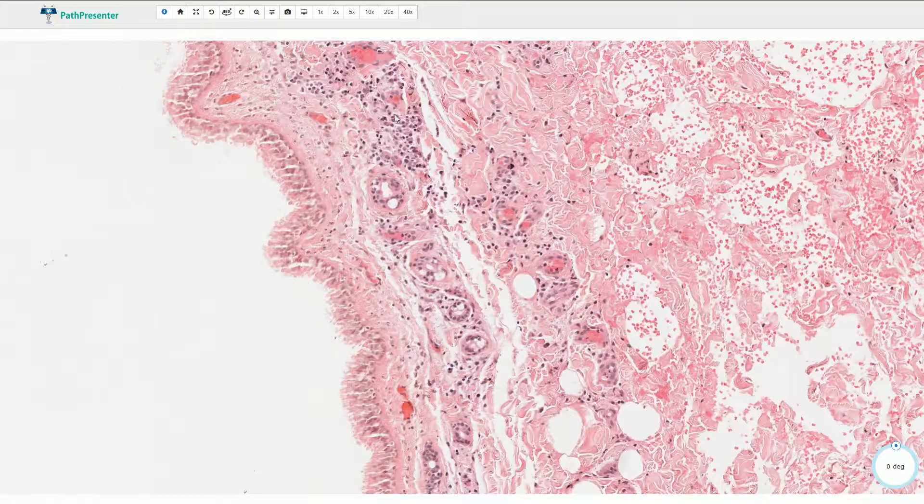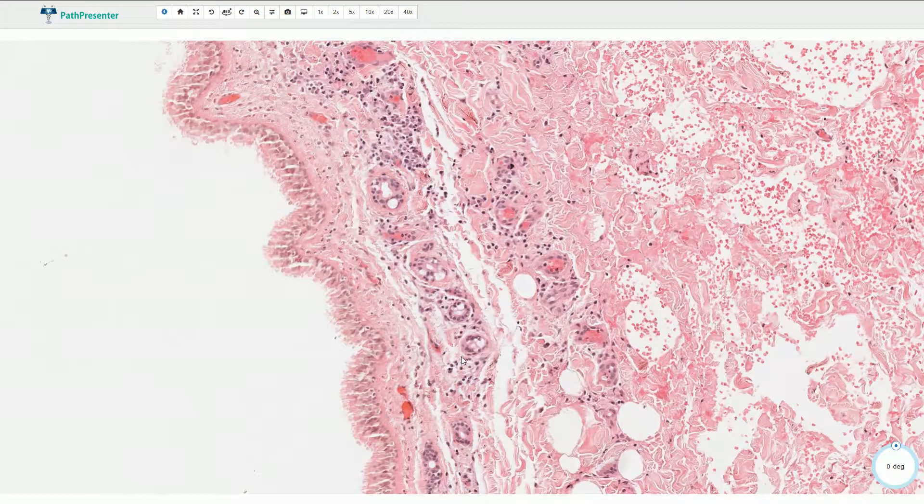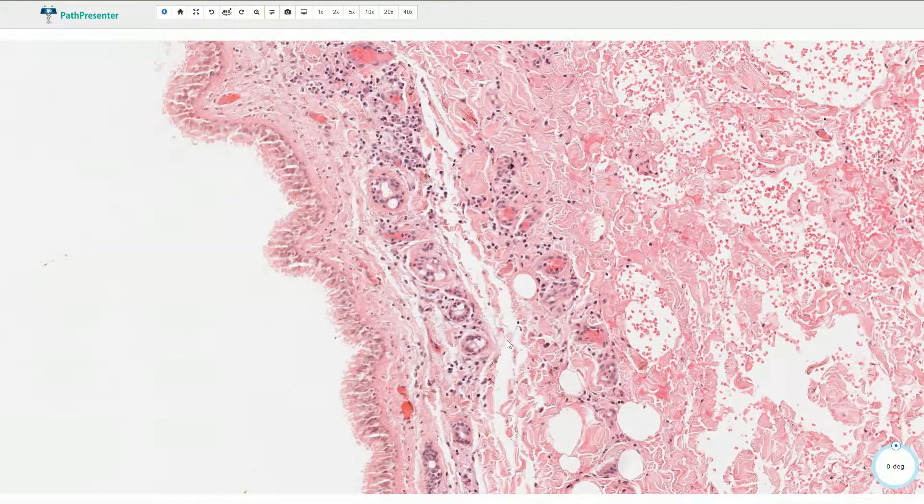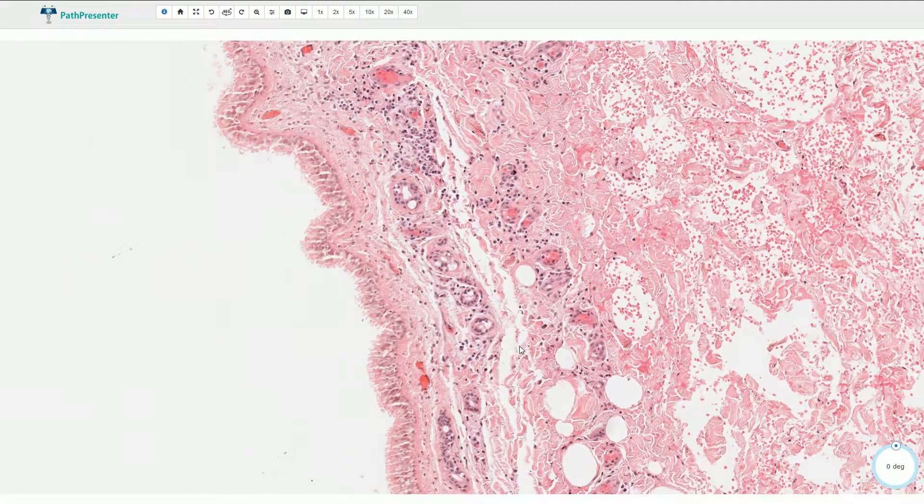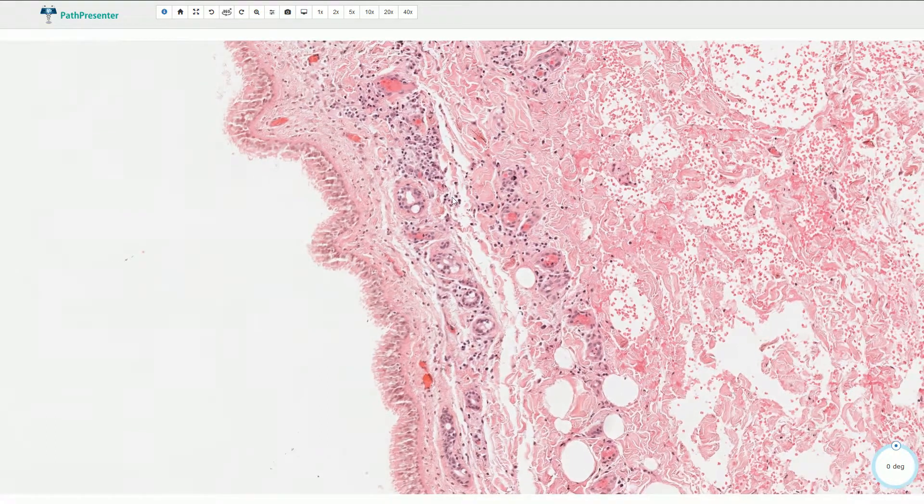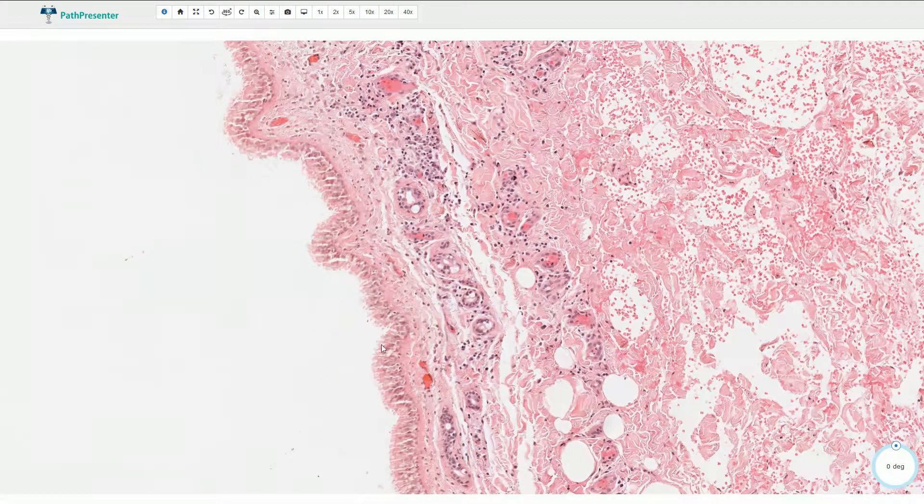Like here, and sometimes we can even find some cartilage, not always and not in this case, but it looks like we are looking at the wall of the bronchus.